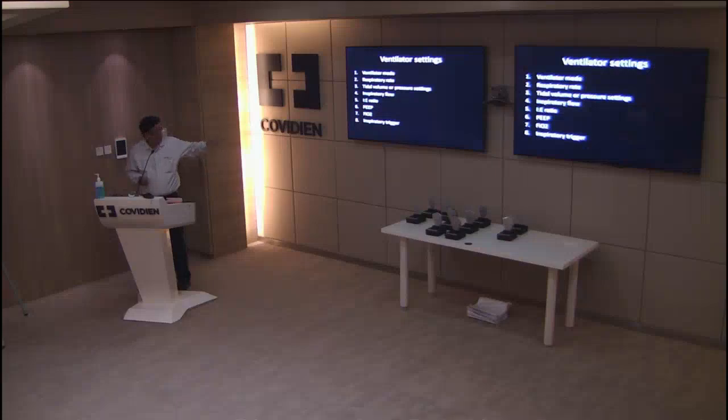So rate, tidal volume and pressure setting. Depending on tidal volume, if it is flow controlled, what volume you want, and pressure, if it is pressure controlled, you obviously can't adjust tidal volume, but you use the pressure which will deliver the volume that you want. Okay.